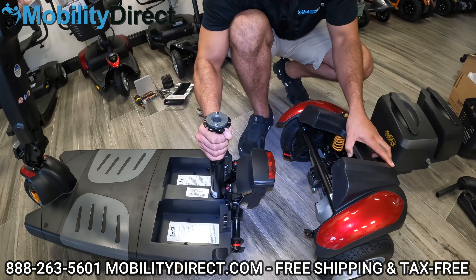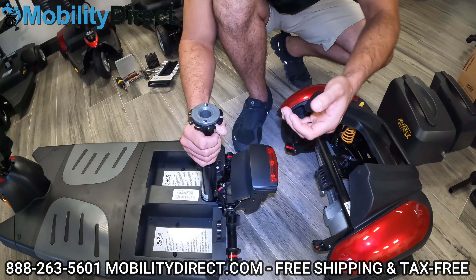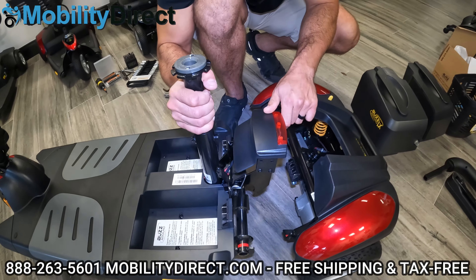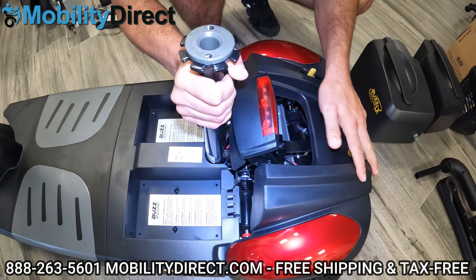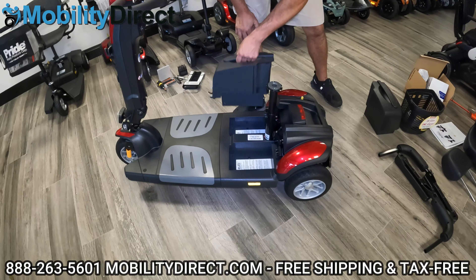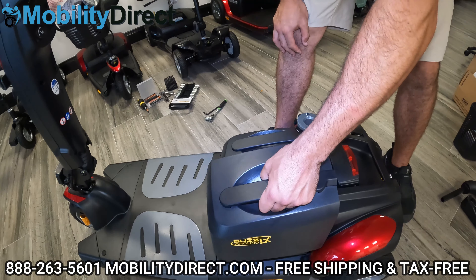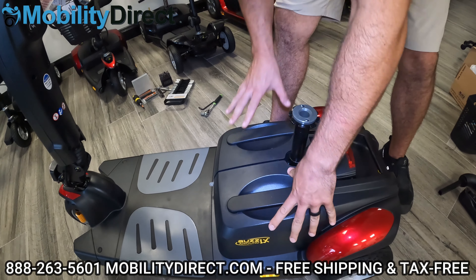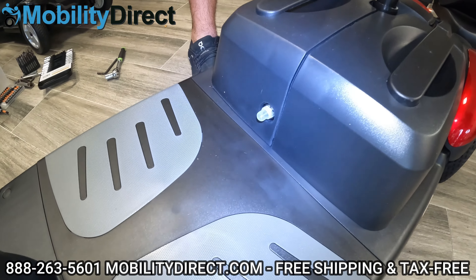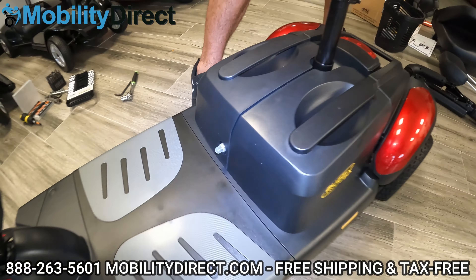To put the frame back together, line up the red stickers on the front part of the frame with the red stickers on the back part — the front bar rests right on the hooks there. Line it up carefully and it just clicks into place. From here, grab your battery boxes and put them in one at a time — be gentle, they should just slip right in. By the way, here's the circuit breaker reset switch. If you're going off-road heavily or going over the weight limit, you might pop a breaker and that's how you reset it.